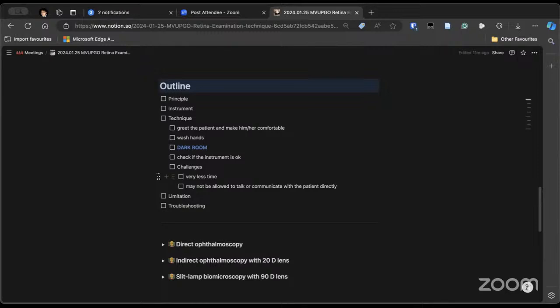A dark room is very important. If you do not darken the room, then there is a very high chance that you might fail. Though if you are very experienced, you may be able to see the fundus in an enlightened room also, definitely ask the people there to darken the room. This is very, very important. Also, before using an instrument, check if it is working okay. This will come when you have practiced a lot with the same instrument, and you will know what is problematic. Even if the instrument is not working well, you will be able to solve the problem before you see the exam.